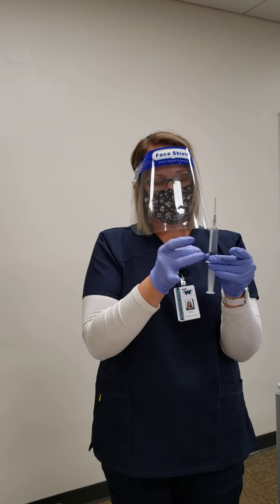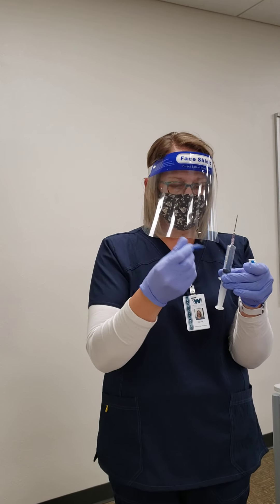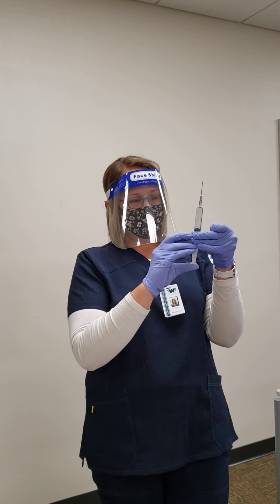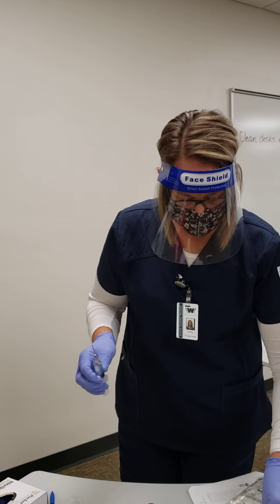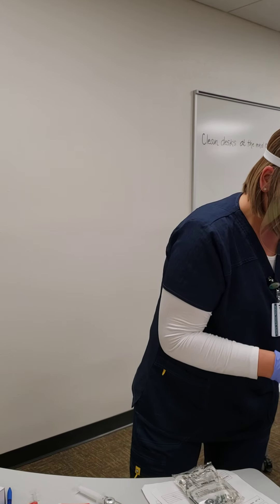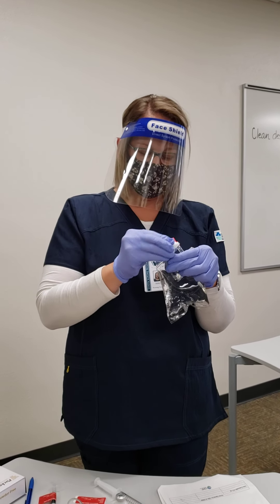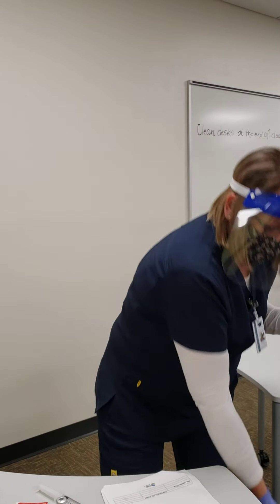I'm going to go ahead and put out all of my bubbles. Once all the bubbles are out, I make sure I'm primed to exactly 10 milliliters of potassium chloride. Then I recap. I use an alcohol wipe on the port for 10 to 15 seconds. This is the port I need to be using for injecting the potassium chloride into the normal saline bag.